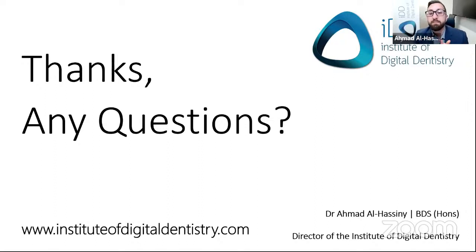I see you asking about standing versus sitting. You have a very keen eye, Maritza. Now, I am just a standing dentist. I find that it's more comfortable for me. I don't think it will make too much of a difference. It's just whatever you're comfortable with. I do find when I'm standing, I can maneuver a lot more around the quadrant and the arch, but it's really up to you. There's a lot of dentists that just sit and scan, no problem.